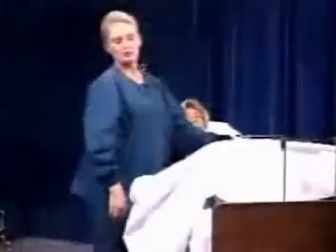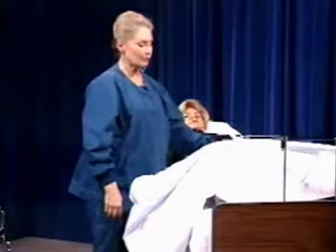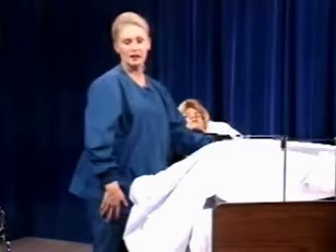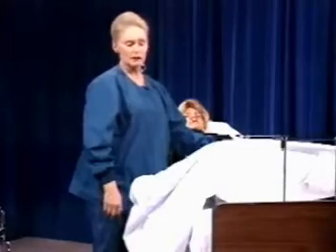It's used to help a patient maintain their total hip precautions, and that would mean no crossing of the knees, no trunk flexion, no sitting up past 90 degrees, and no rotation of the hips. Let's now look at some heel supportive equipment.